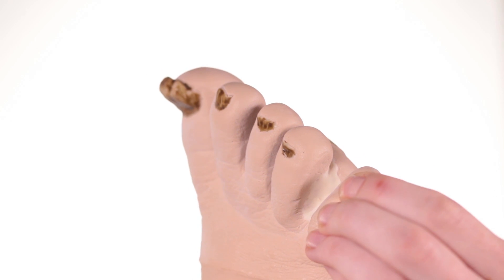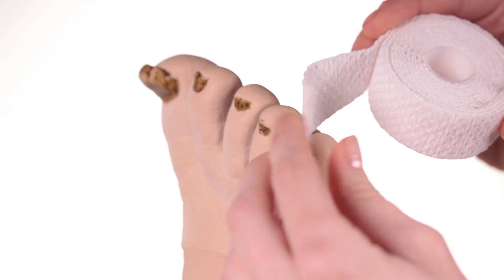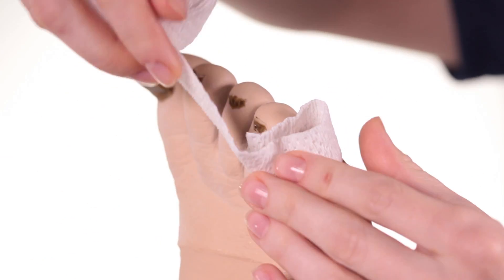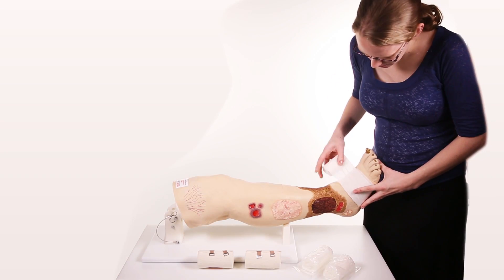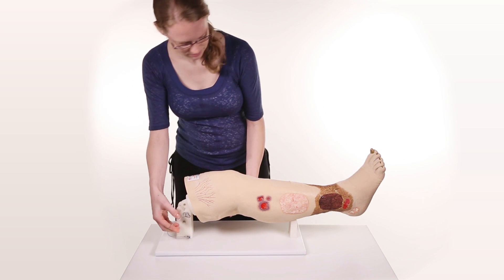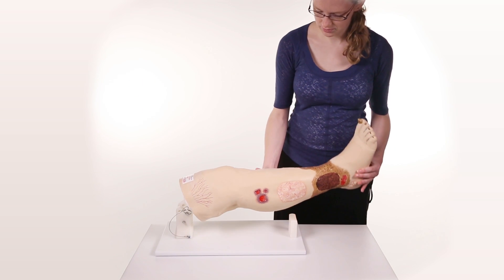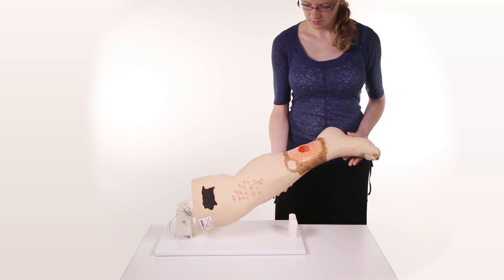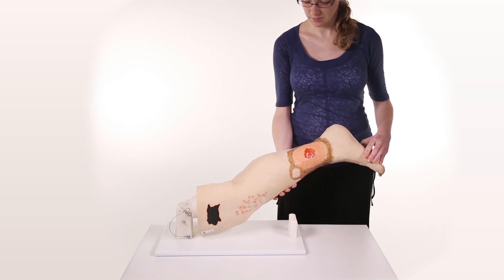The toes are soft and pliable and able to be individually wrapped for compression wrapping. An optional display stand, model 0552, is available, which permits the leg to pivot while practicing compression wrapping or rotating the leg for demonstration purposes.